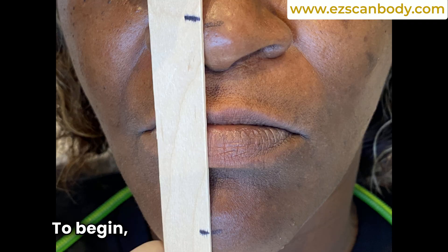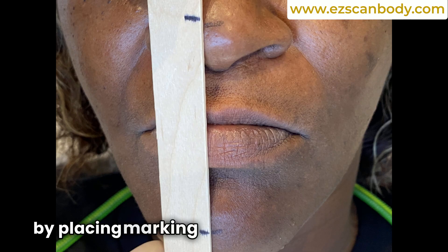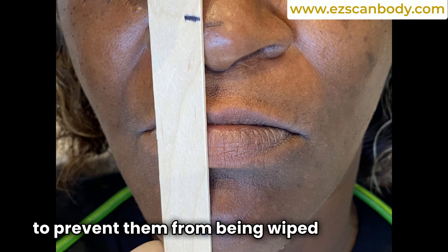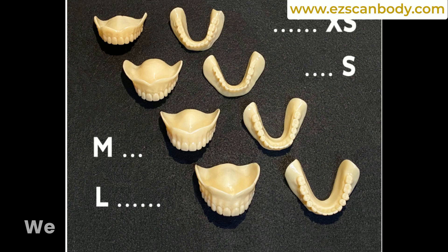To begin, we measure and mark the vertical dimension by placing marking dots on the nose and cheek using a tongue depressor or plastic ruler. Be sure to securely tape the marks to prevent them from being wiped or cleaned off during the procedure.